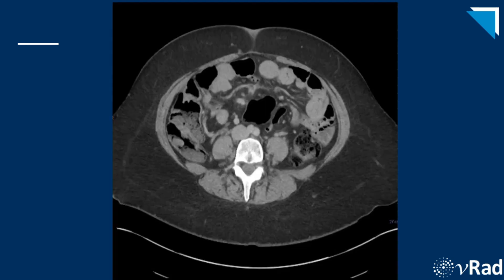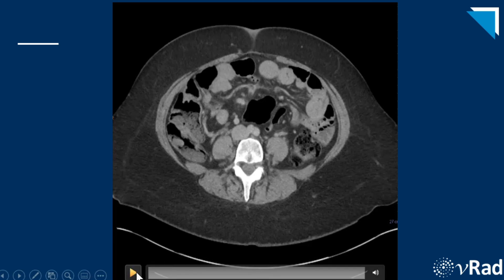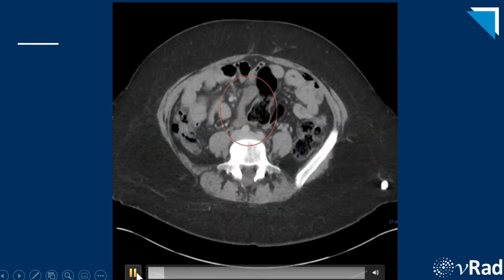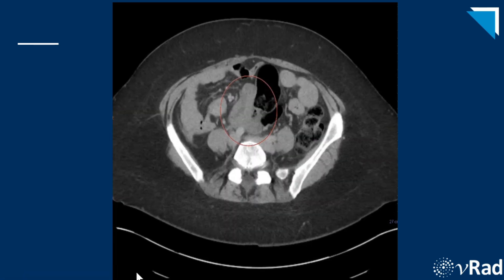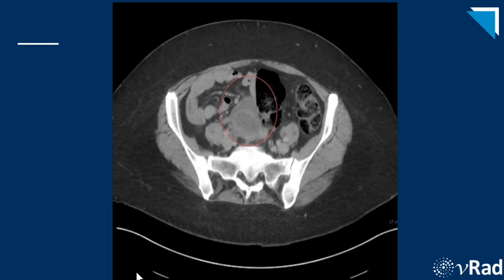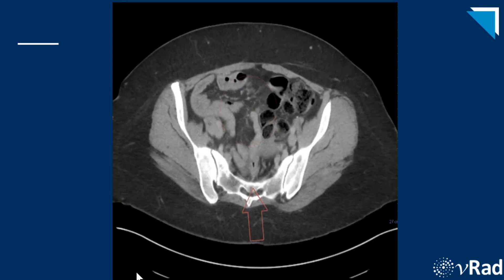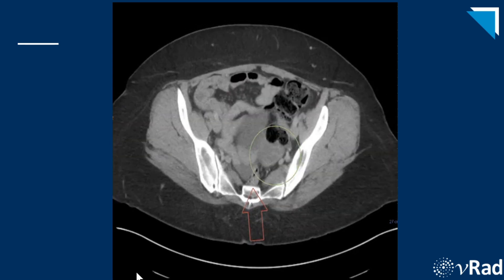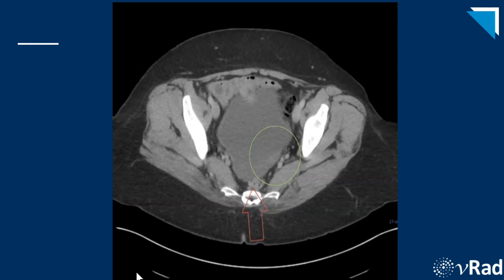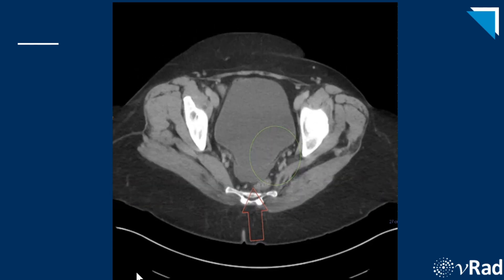Here is the classic appearance of torsion on CT. Within the red circle is the enlarged midline pelvic mass, which is the torsed right ovary. The green circle surrounds the normal left ovary, and the red arrow points to some complex pelvic free fluid.